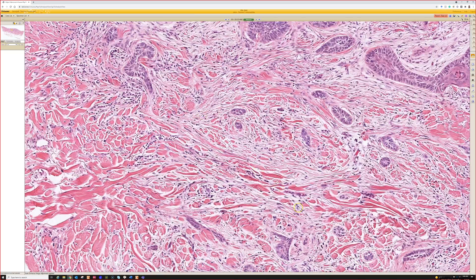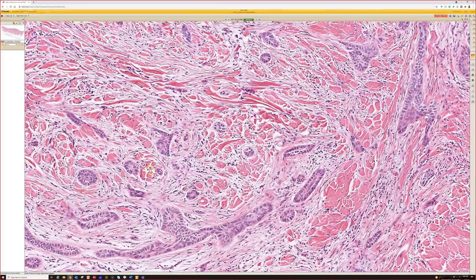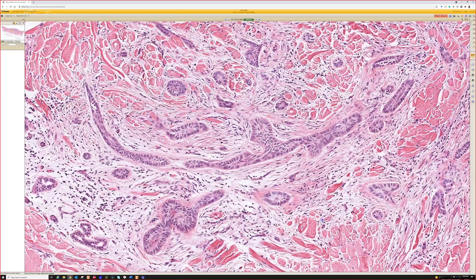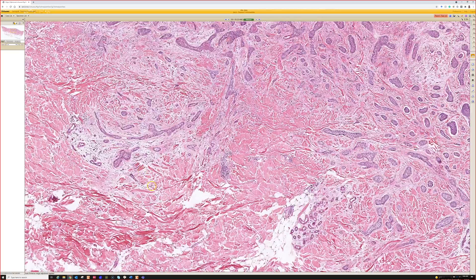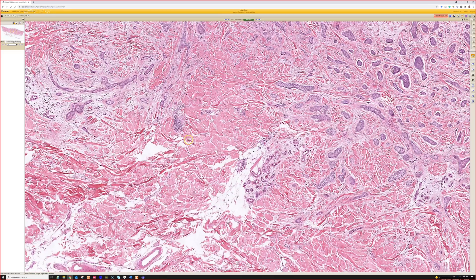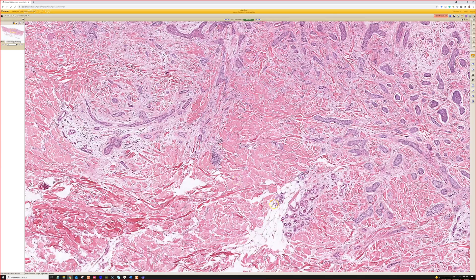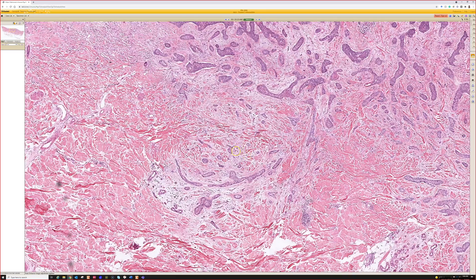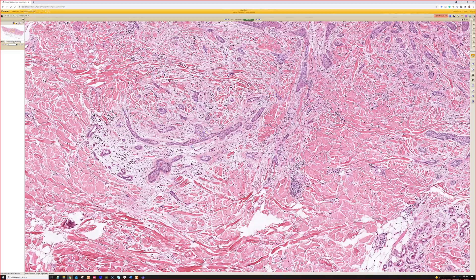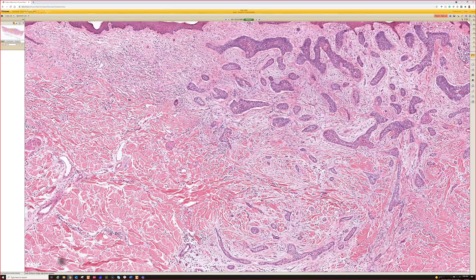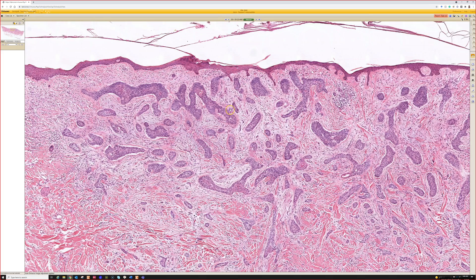I promise I found it — I thought I can find that again tomorrow, but there was no way to mark it. There was a nerve involved somewhere on this side. I was going to be so impressive showing you. But in any case, when you see a tongue of tumor for any carcinoma going way out away from the rest of the tumor, always look closely for perineural invasion. In basals it's not as significant, but they're harder to clear and take more layers.